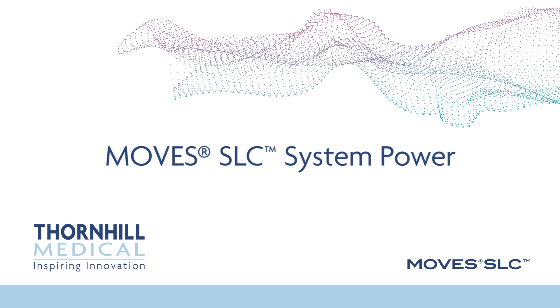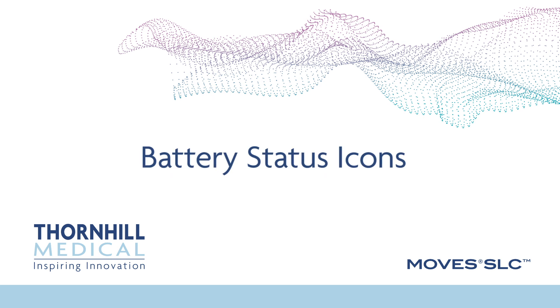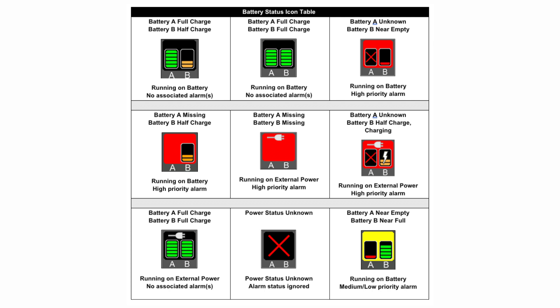MOVES SLC system power. Battery status icons show the charge of the two system batteries individually and indicate if external power is connected. Left is battery A and right is battery B. The plug icon indicates that wall power is connected. A charge icon is displayed on the battery icon if the battery is charging. If a battery icon is missing, then the battery is not connected. If a battery appears to be installed but is shown as missing on the display, inspect the battery and replace or reinstall. When an alarm associated with the system power is active, the area behind the battery status icons is highlighted with a red background if the highest associated alarm is high priority; otherwise, a yellow highlight is used for medium and low priority alarms.